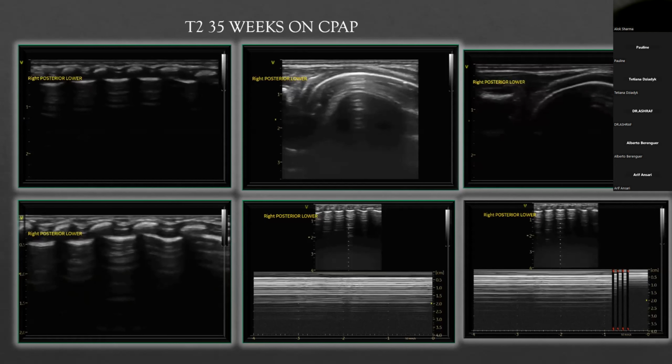And if I can see sliding with a seashore sign in all those areas, then I'm absolutely certain that this is actually an artifact, either because maybe harmonics is on. The other possibility might be that I haven't got gel on the entire probe uniformly.